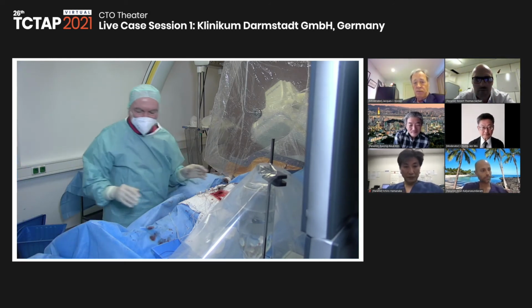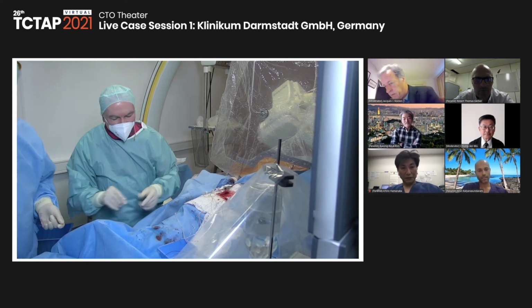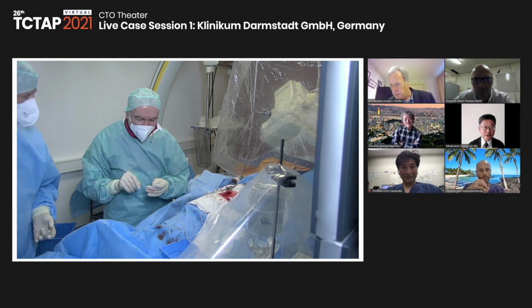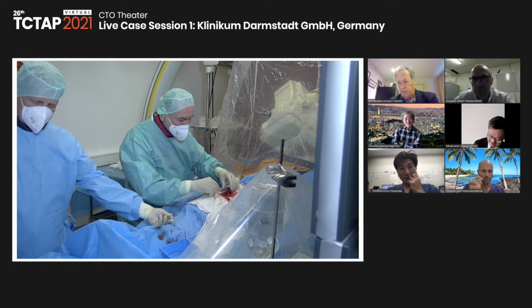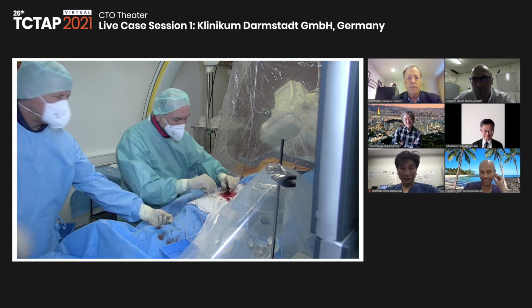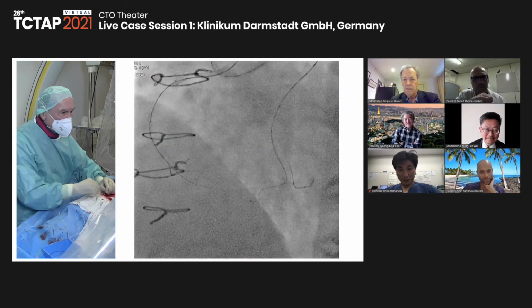I would love to have the Miracle Neo 3, which is available in Japan. It's a fantastic wire. Unfortunately, not exported to the EU. I'm not sure whether it's available in Taiwan. Not yet, not yet. It's been there for 4 years. Yeah, I had occasional samples. I don't understand why Asahi is holding back this wire.